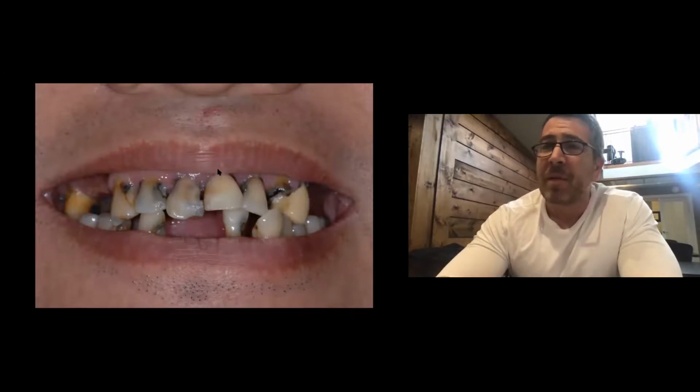Full clearance. From the photos alone, you should be able to look at this. When this patient loses these teeth, if I place implants for the purpose of a bridge, that's fine. I can make him look like he did before. But if I want to place a denture, this transition zone of where his lip is and where his smile line is, if I don't give enough clearance on this case, then I'm going to have a problem with the prosthetic transitioning off of the implants. So it's going to need some reduction.